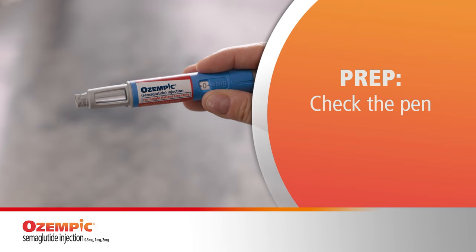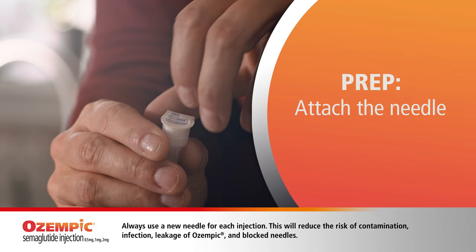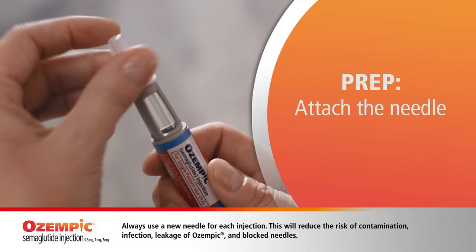So the first thing I do is prep my pen with a new needle. I make sure that the label on the pen matches the medicine that I was prescribed to take, and the liquid in the pen is not cloudy. See, it should be clear. Like this. Looks clear to me.